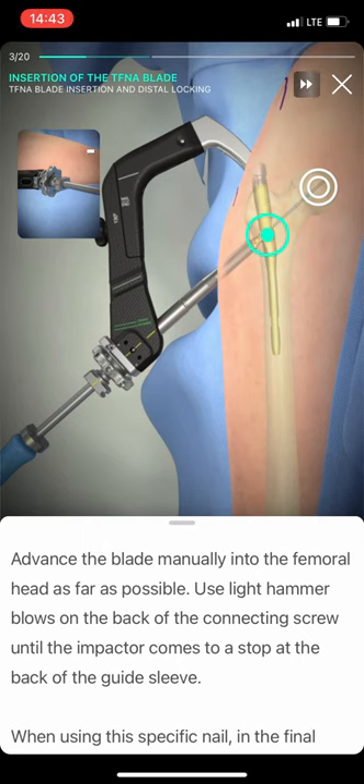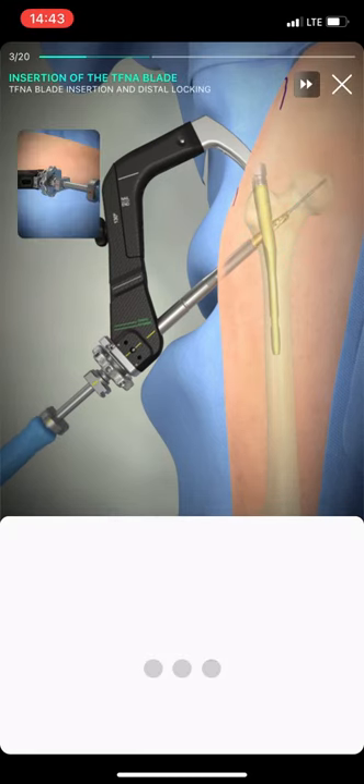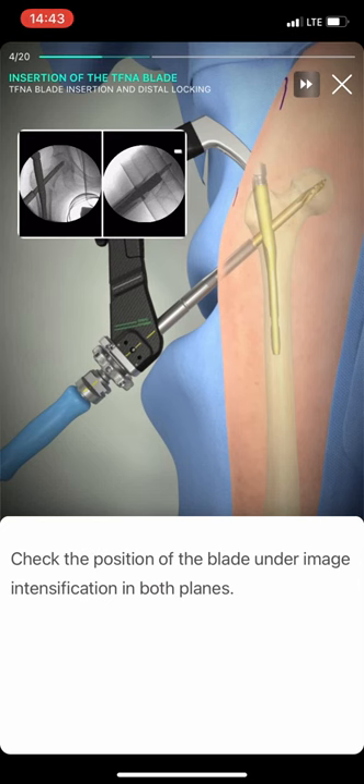Advance the blade manually into the femoral head as far as possible. Use light hammer blows on the back of the connecting screw until the impactor comes to a stop at the back of the guide sleeve.